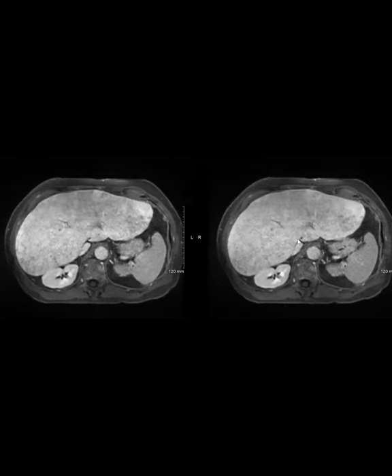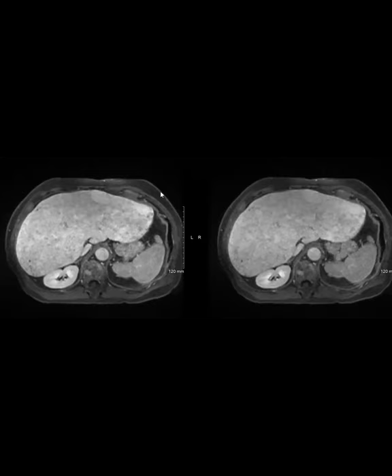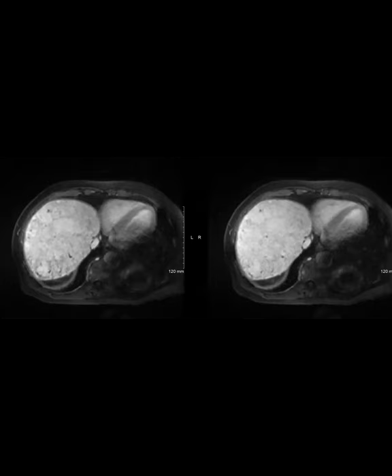It almost reminds me of peliosis or some kind of vascular congestive process. Right. So vascular process is a good thought. It is a vascular process, but peliosis, I've never seen one in real life. I think they don't generally have restricted diffusion, but don't quote me on that. Anyway, it did look like there's some sort of vascular situation happening. So we ended up biopsying him, and this is diffuse angiosarcoma involving the liver.